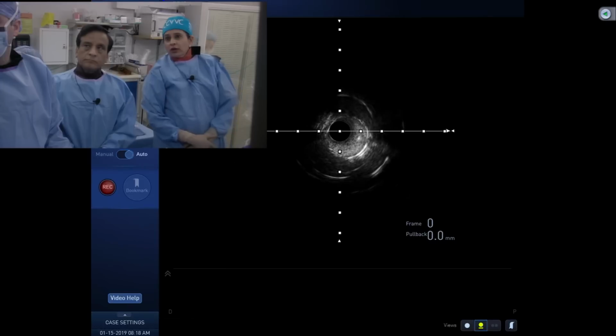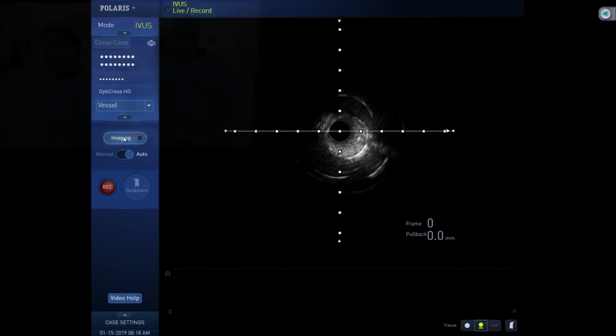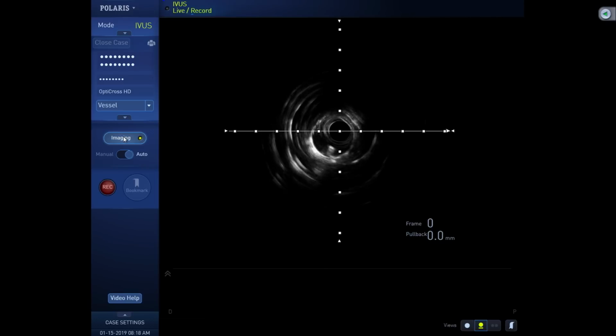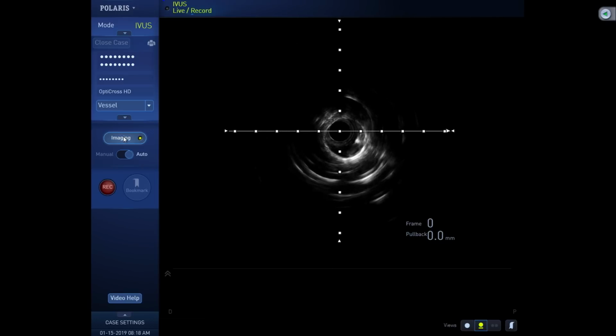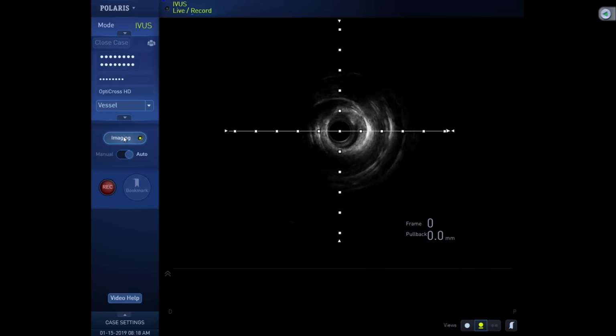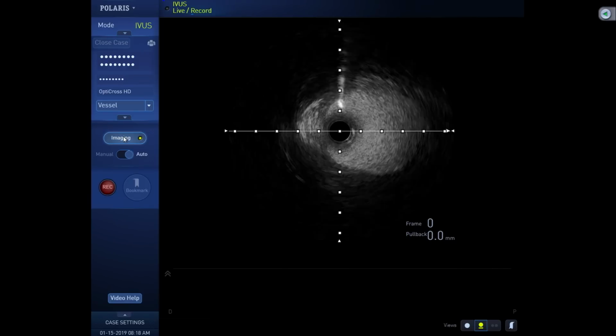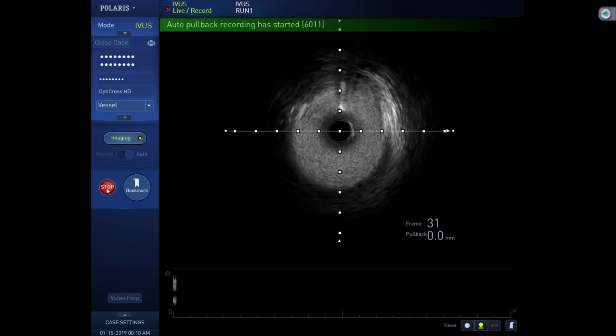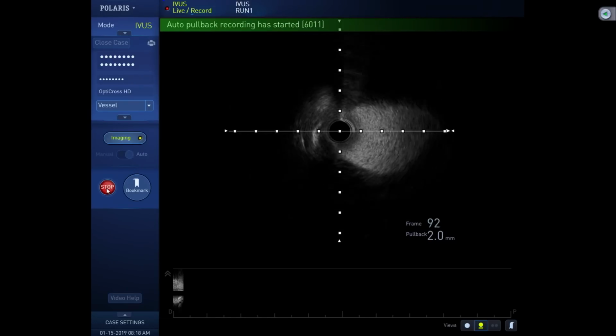No, not that. Just the distal left main. We recorded. Okay, let's flush and do it again. Yeah, we see it now. We're going to do it quick, flush and go again. Okay, let's flush a little better. You have to pull back. No, pull back first. A little flush. Okay, now go in. Now, why should it not be going?